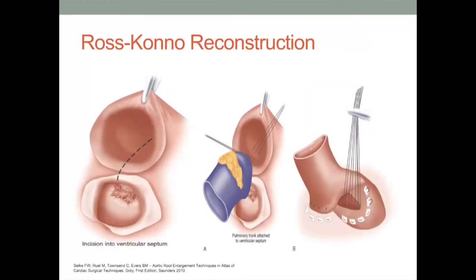Hypoplasia of the left ventricular outflow tract and concomitant pathology of the aortic valve can be addressed successfully by combining the aortoventriculoplasty with pulmonary autograft replacement of the aortic valve. Harvesting of the pulmonary autograft is accomplished by carefully dissecting the pulmonary artery off the aorta and transecting the pulmonary artery to ensure appropriate anatomic visualization of the pulmonary valve leaflets.